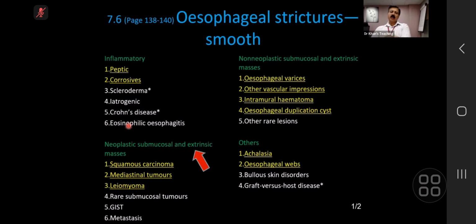Having said that, classically in the exam, they will show you cases in which there will be benign etiology. One thing which I want you to remember is scleroderma. Now, scleroderma is an extremely important exam case. It can come as a long case. It can come in so many different films. Scleroderma involves the whole of the bowel, so they can show you esophagus or a small bowel or large bowel.